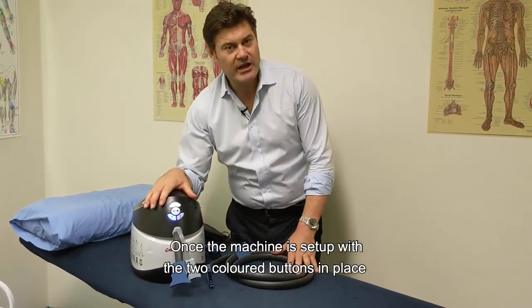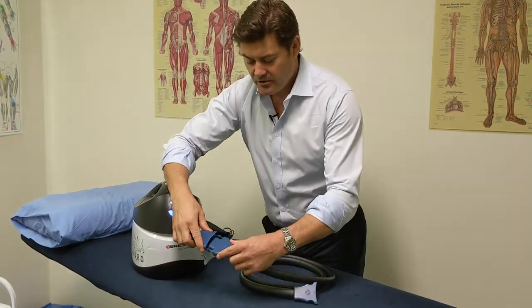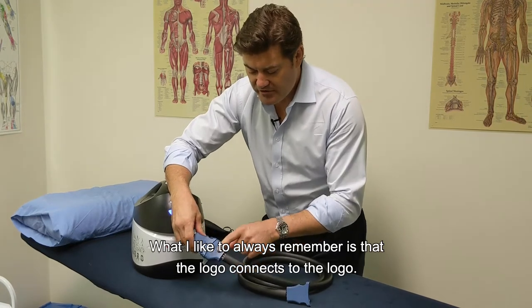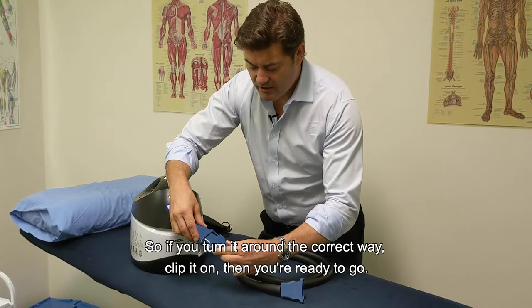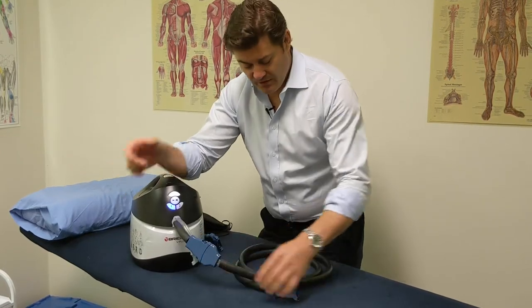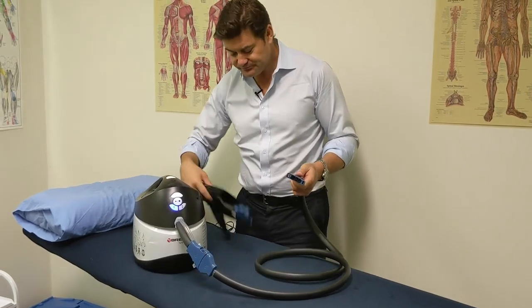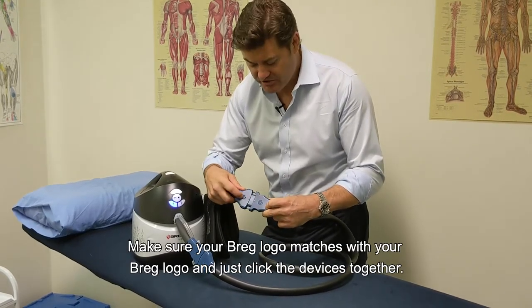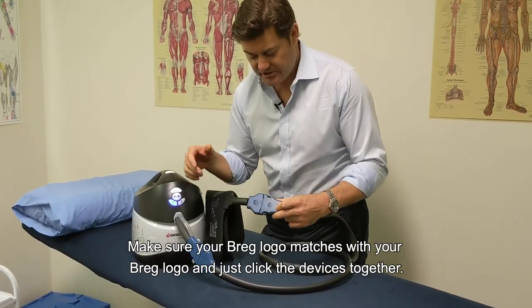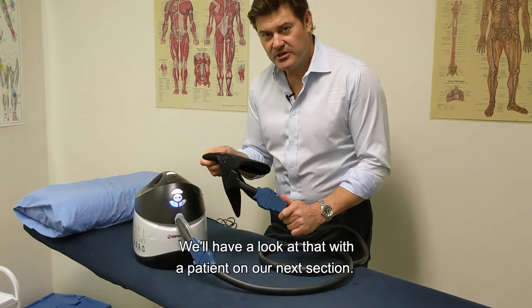With the two colored buttons in place, connect the extension tubing. A helpful tip: the logo connects to the logo — if it won't connect, simply turn it to the correct orientation and clip it on. The other end connects to your personalized pad in the same way — make sure your Breg logo matches the Breg logo and click the devices together. We'll look at how this connects to your body part with a patient in the next section.